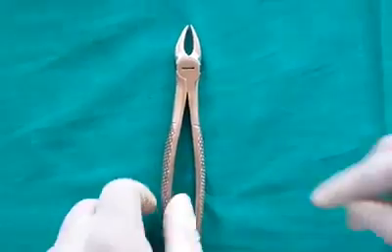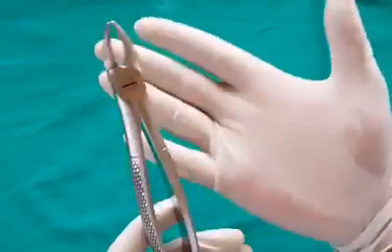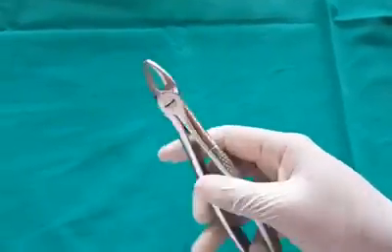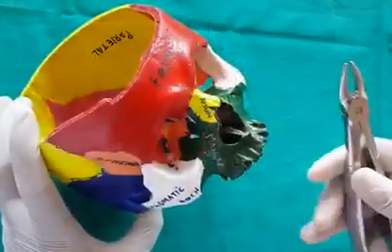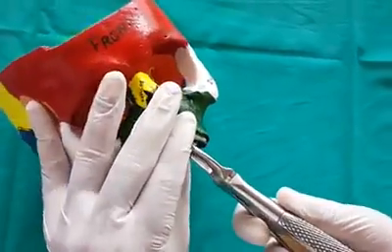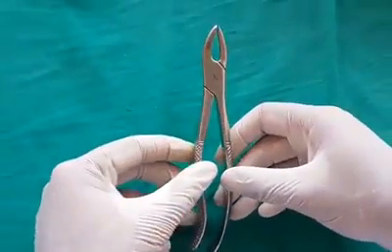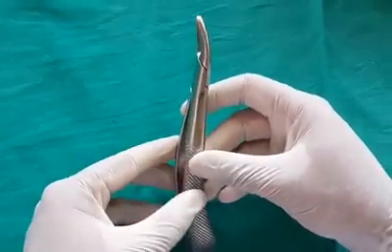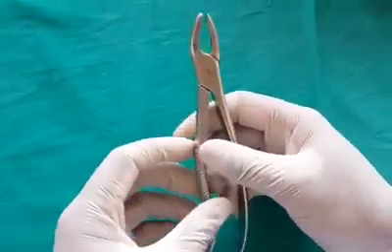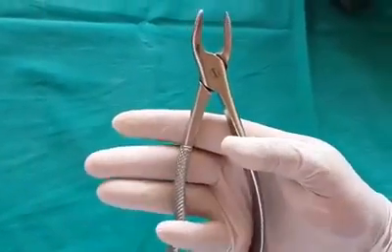Maxillary anterior forceps are used for the extraction of maxillary anterior teeth, and this forceps is completely straight. Maxillary premolar forceps are used for the extraction of maxillary premolars. They are slightly curved, and held so that the concave part of the handle rests on the palm.